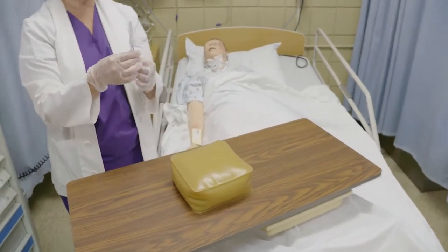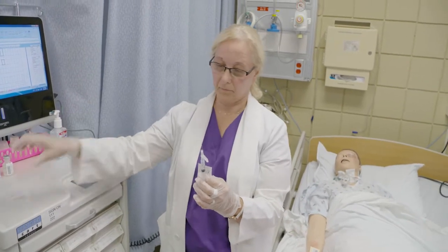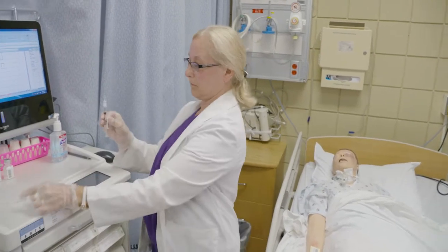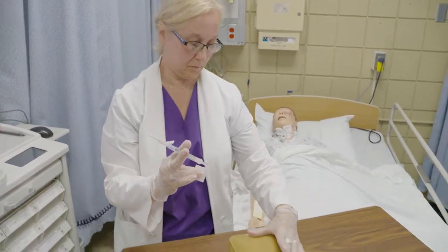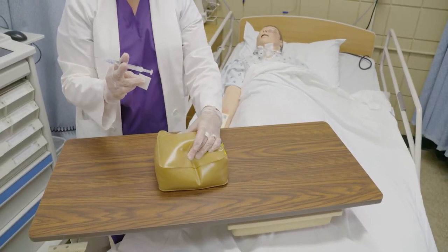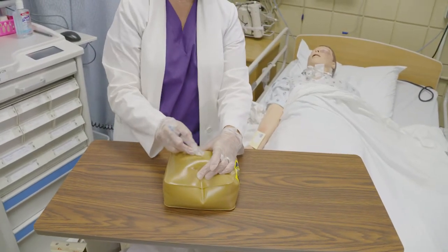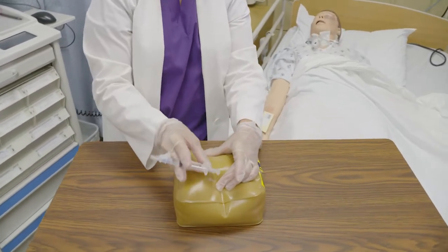Hold the syringe in your dominant hand. Take off the cap. Make sure the bevel is upward. Hold the alcohol pad between your ring finger and thumb. Pinch the tissue at the injection site using your non-dominant hand and hold. This prevents you from accidentally injecting into the muscle. Cleanse the site in a circular motion with the alcohol pad. You can lay the alcohol swab near the site.